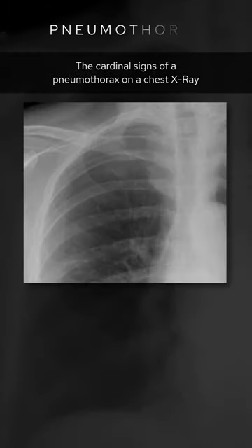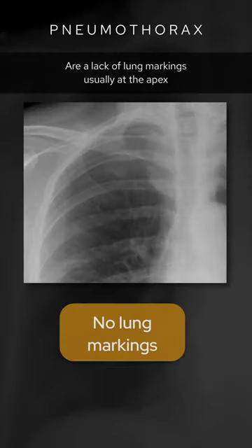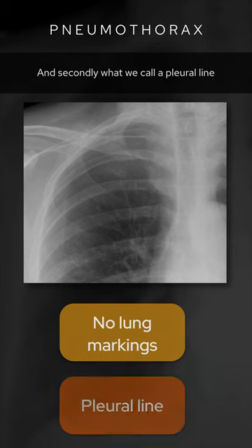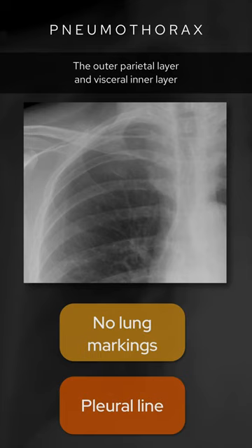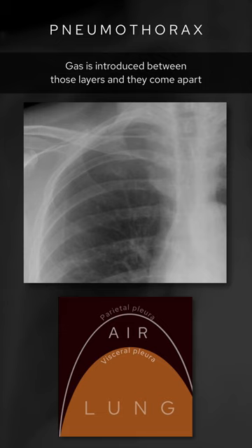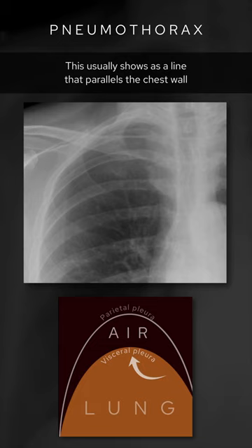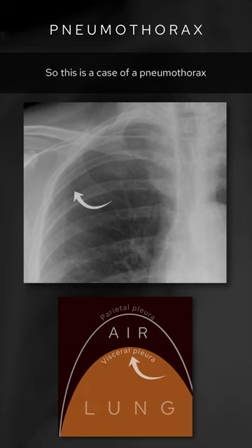The cardinal signs of a pneumothorax on a chest x-ray are a lack of lung markings, usually at the apex, and secondly what we call a pleural line. There are two layers to the pleura: the outer parietal layer and the inner visceral layer. In a pneumothorax, gas is introduced between those layers and they come apart. You should be able to see the visceral pleura as a thin white line that parallels the chest wall, and I think that's what we can see here. So this is a case of a pneumothorax.